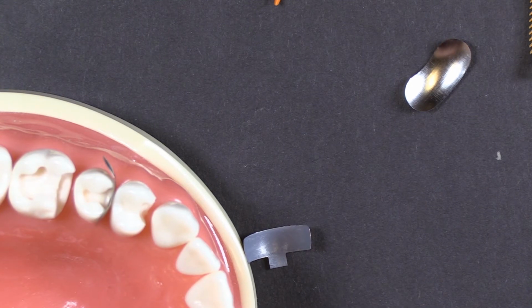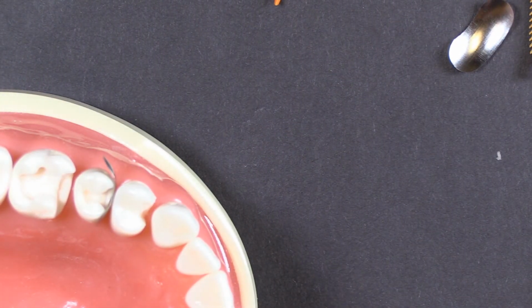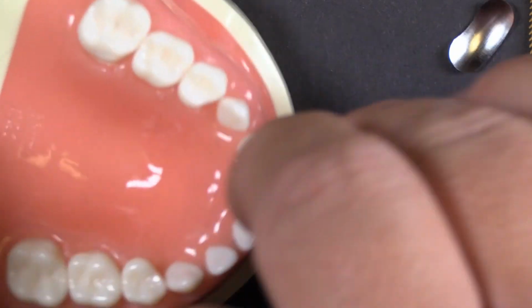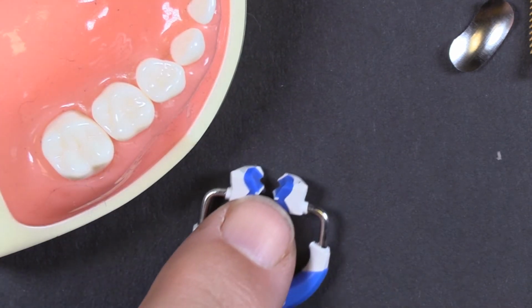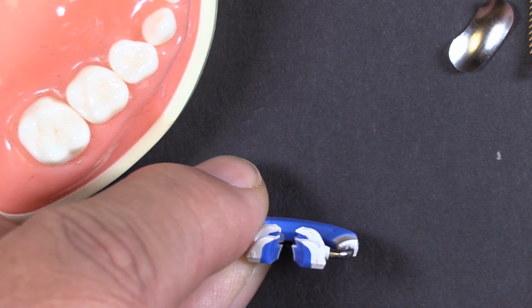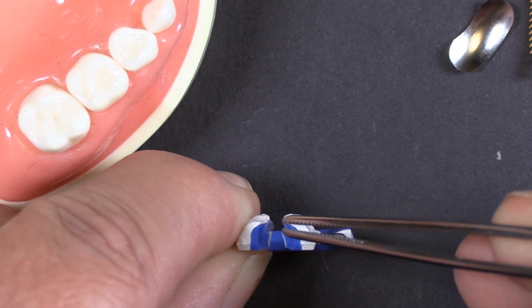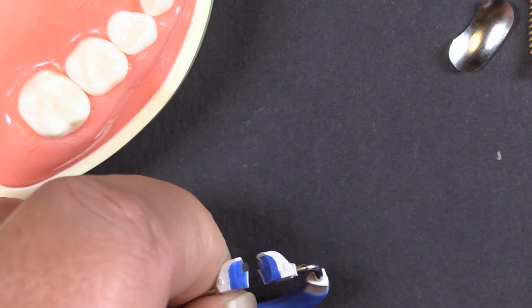So we're going to take a look at those couple of topics, all related to ring placement and secure ring placement. I've got a little pedodontic model here. On the pedo teeth or any really short teeth, you want to use one of the new Fusion rings, the short ring. Again, here you can see it's got the addition of the prongs at the bottom that really help to grip those shorter teeth.